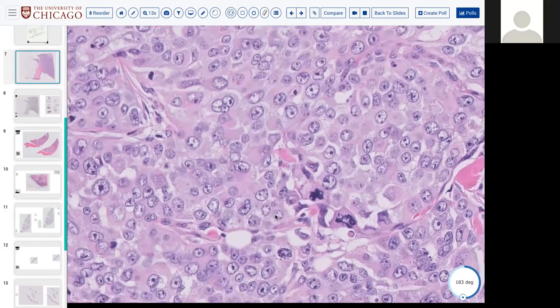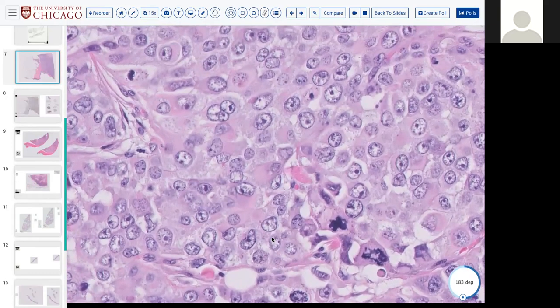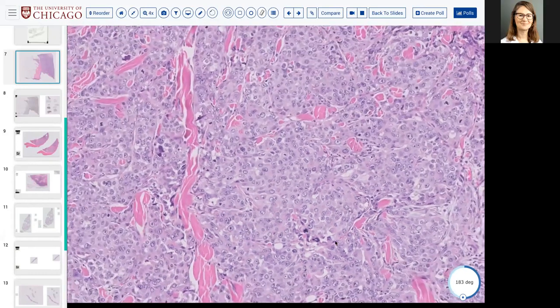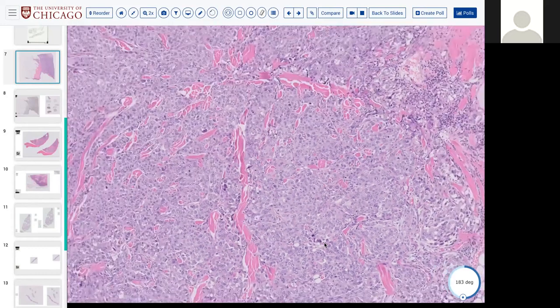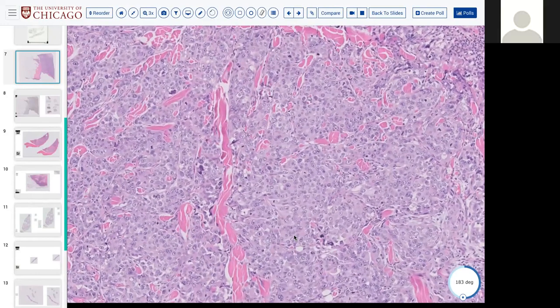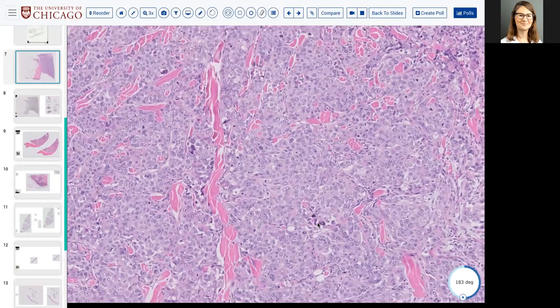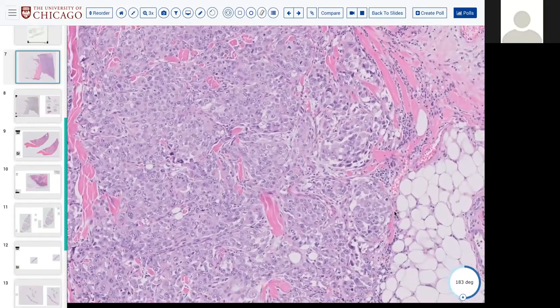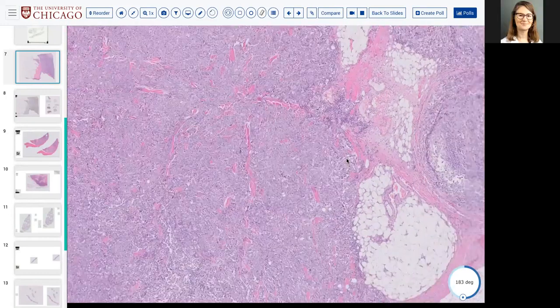Right. And I was wondering to myself whether the lesion was vasoformative because I saw some slit-like spaces. There are vessels that might also be entrapped. So that's a question. Is it vasoformative or is it entrapped vessels? Okay. So the cells are epithelioid, if I didn't mention that, and sheet-like. And I think at the periphery it was sort of infiltrative because it was sort of ill-defined.